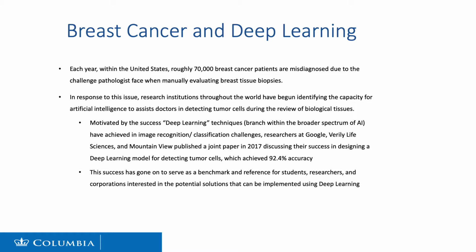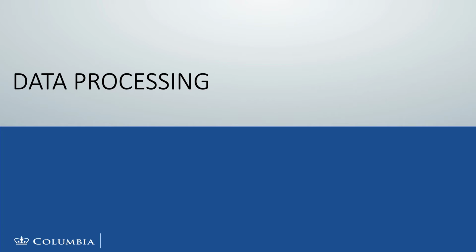We use different colors to label them, and at the end, we map all those labeled small parts together to form an entire slide, an entire picture, such that we can also achieve our goal to predict the cancerous region. In terms of our work, first we want to talk about the data processing part.